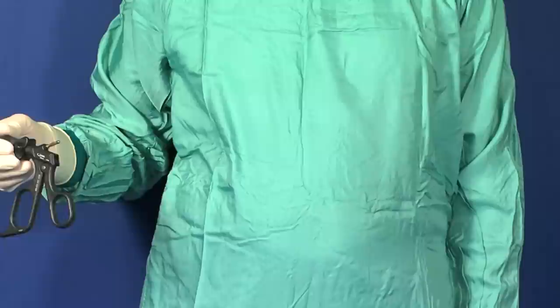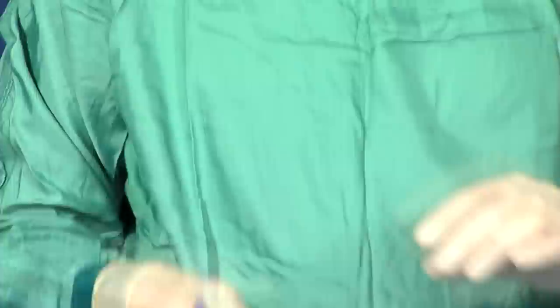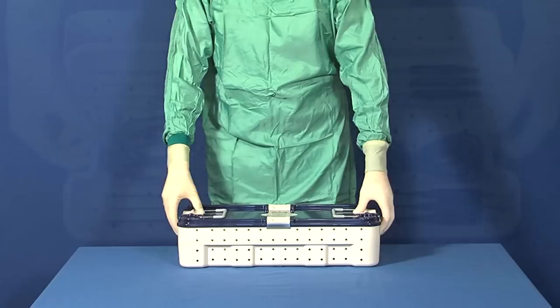The instruments and the electrodes are electrically insulated and can be connected to the electrosurgery unit. A monopolar cable and a bipolar cable with 4 mm single pin plugs are supplied. Other cables for specific electrosurgical units can be ordered separately. All of these instruments come packaged in a sterilization container suited for standard practices and autoclave sterilization at 134 degrees centigrade.